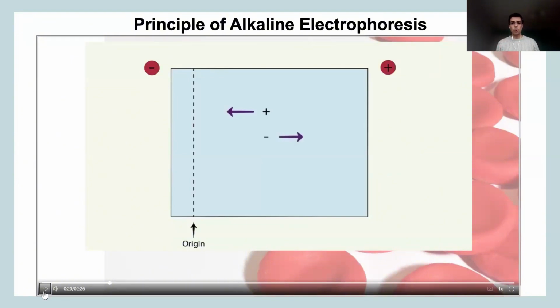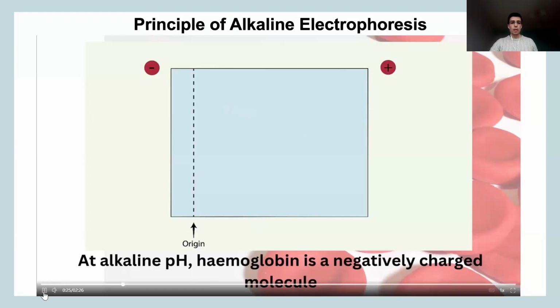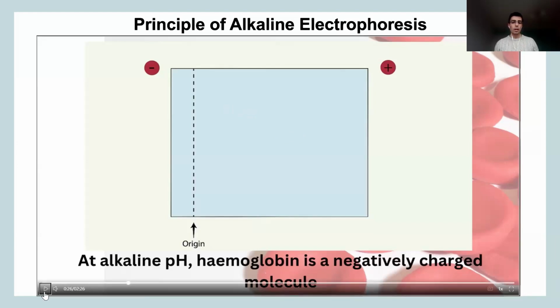If the molecules are positively charged, they're not going to progress very much towards the positive pole. But a negatively charged protein is going to move towards the opposite charge. And to move along, it's important to remember other methods of electrophoresis. We're looking at alkaline, but you also have the acid. Yet again, I'm just focusing on the alkaline because the acid will have slight differences as well.